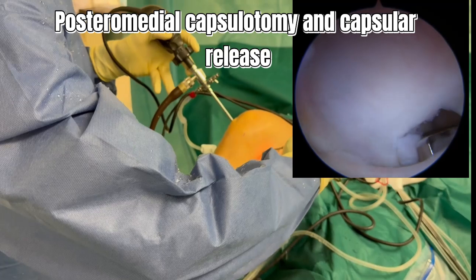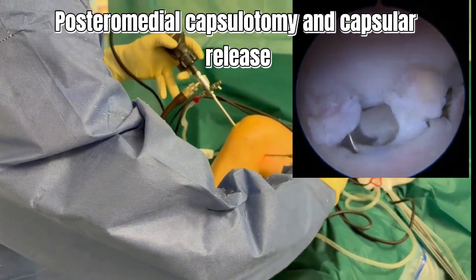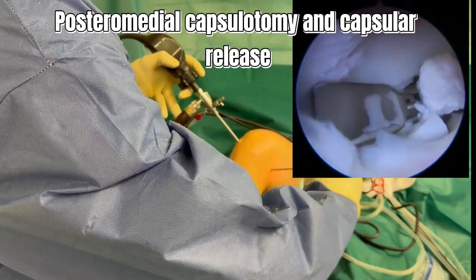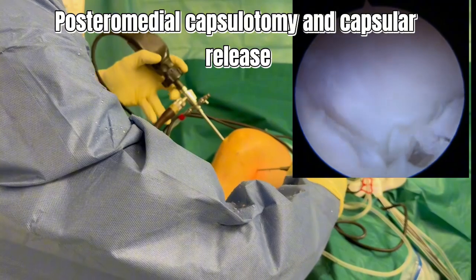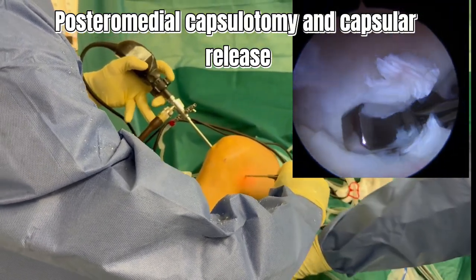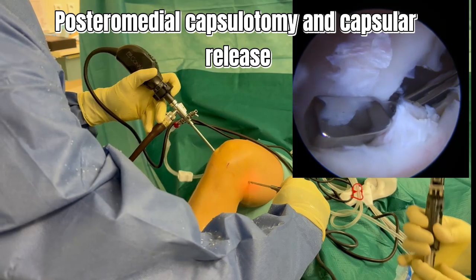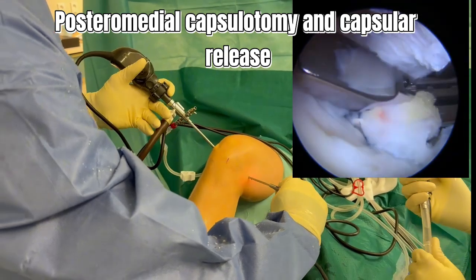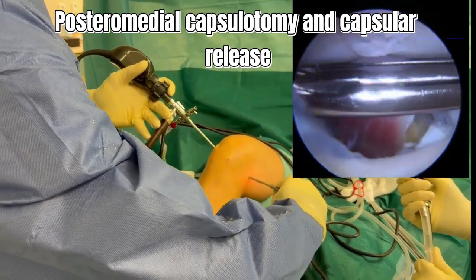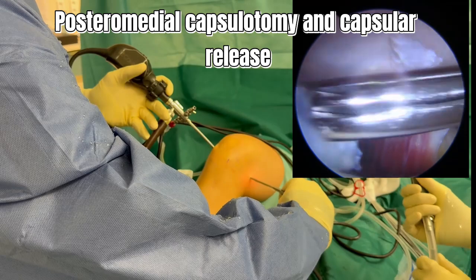Capsulotomy and capsular release continue laterally and inferiorly with basket forceps, dissecting the capsule from the tibial plateau until gastrocnemius muscle fibers are visualized. The capsular release is extended laterally up to the central septum.